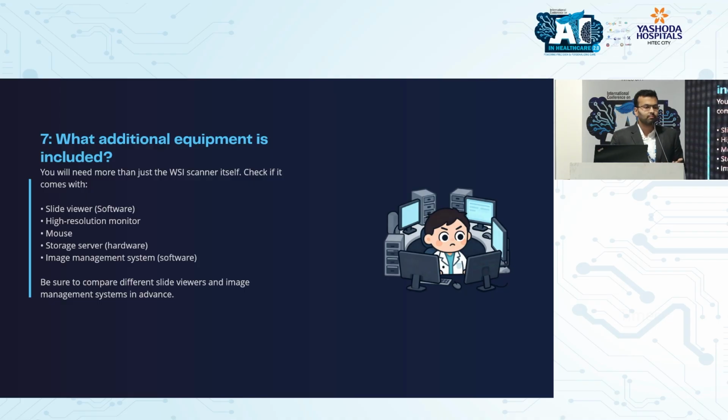Right, so for example, creating a storage server. Each scanner will come with a server that has got a basic data capacity. Like it can store maybe 500 scans or 1,000 scans or 2,000 scans. You need to work closely with your vendor to figure out a way to increase that capacity without adding cost.